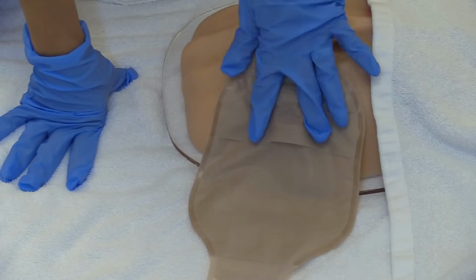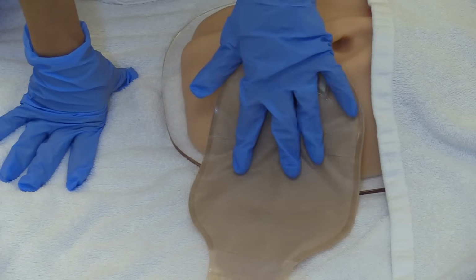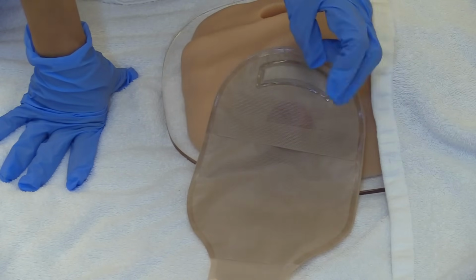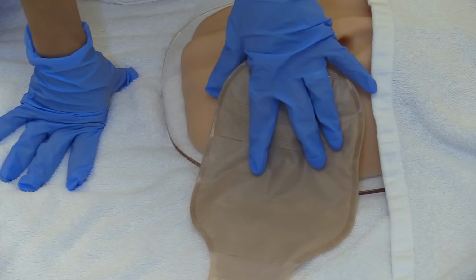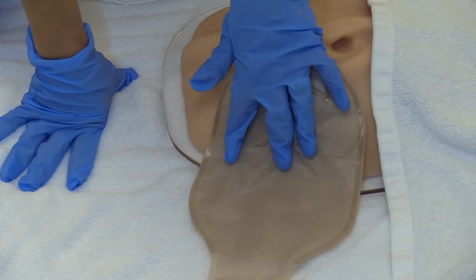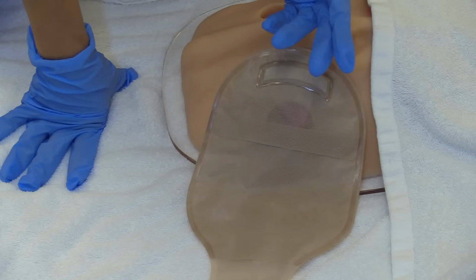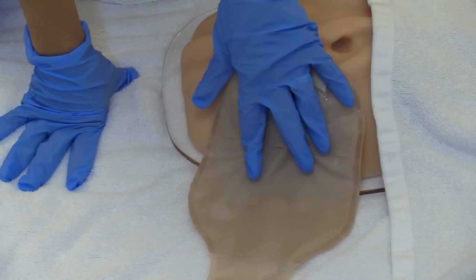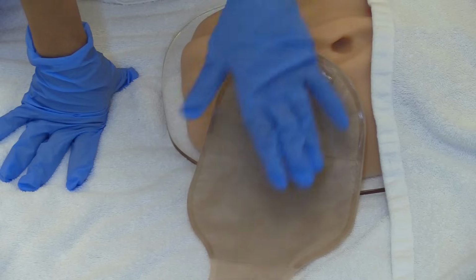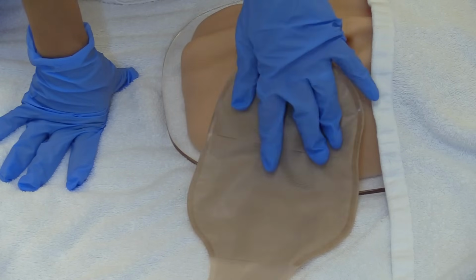Now, some things you want to keep in mind. If this is a new ostomy for the patient, you want to explain to them that they need to be checking their bag every so often because it can inflate with gas, and they will need to do what's called burping their bag. And to burp this particular bag, you would take off this clip and just let the air out. Now, some ostomy bags do have a filter that allows the gas to escape and prevents an odorous smell from coming out. So you just have to look to see what you have, and just warn the patient that when they do relieve the gas from their bag, they may want to make sure that no one's around if someone's visiting them or something like that, because it can produce an odorous smell.